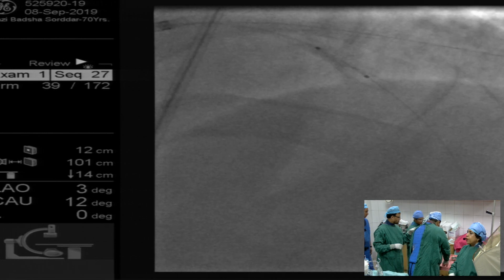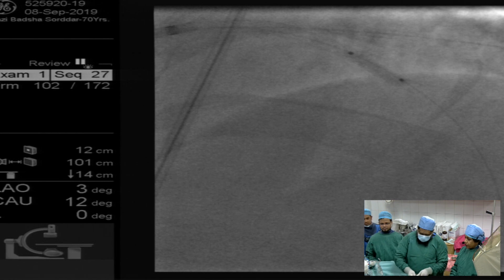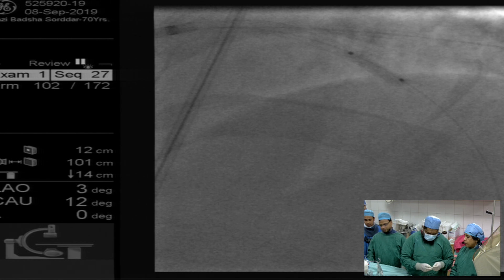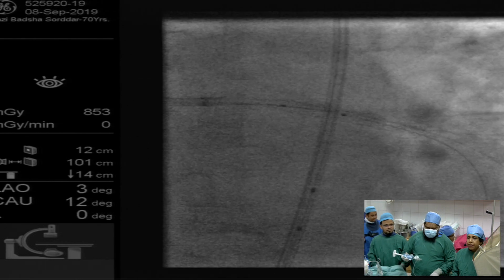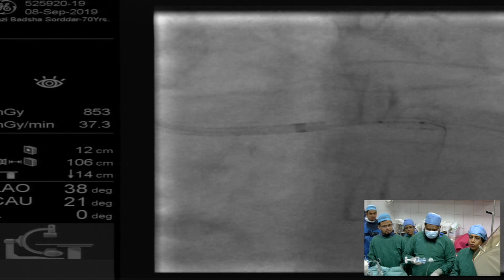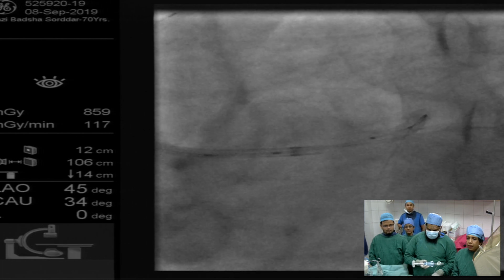And we are all very excited about the OCT and the angiographic co-registration, because we are part of a trial and we'll soon start recruiting patients to see how OCT optimizes our results. It's going to be a very exciting chapter in imaging, I feel, especially with distal left main disease. I mean, you need some form of imaging. Personally I feel IVUS is a great tool, but my experience with OCT is not that extensive. So we need to learn about OCT, and I'm sure it's going to be very, very interesting.